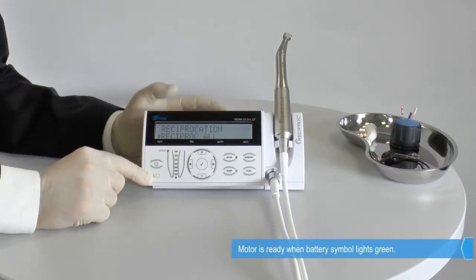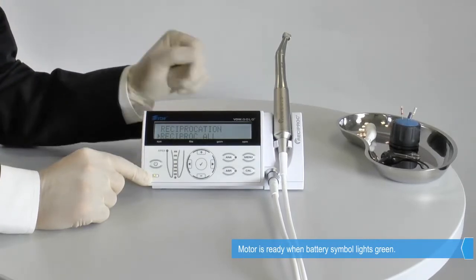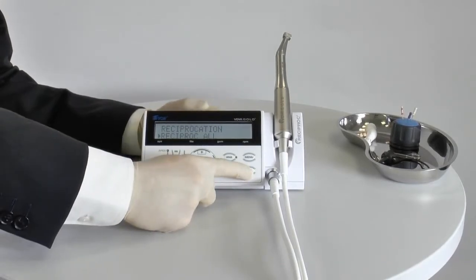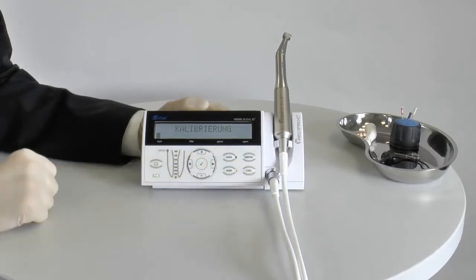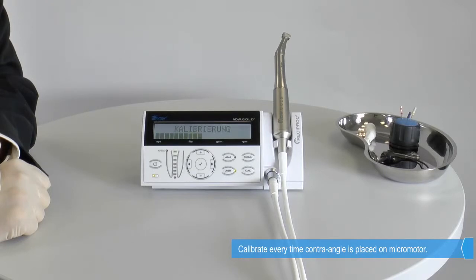After proper care and maintenance, the contra angle can be put on the micro motor. Then press the C-A-L key. The calibration is important to ensure the contra angle's torque accuracy. The contra angle needs to be calibrated every time it is put back on the motor.